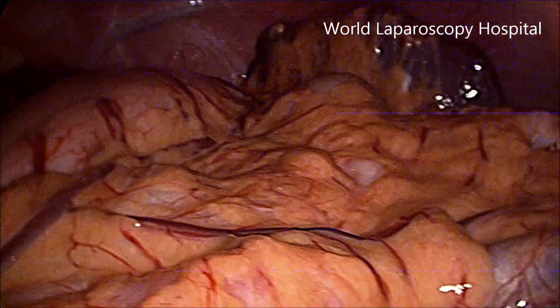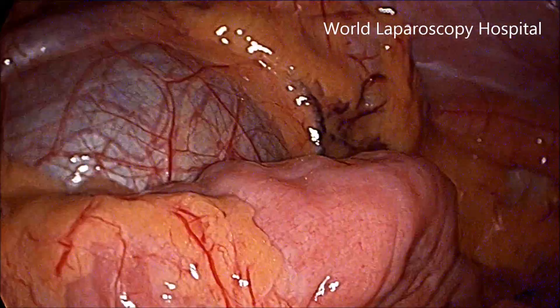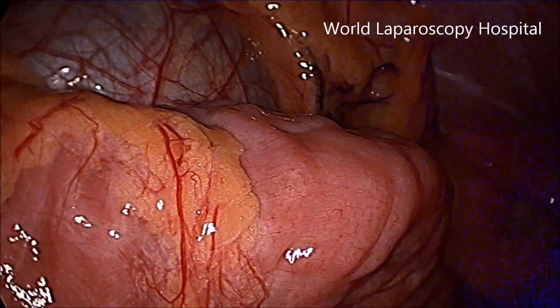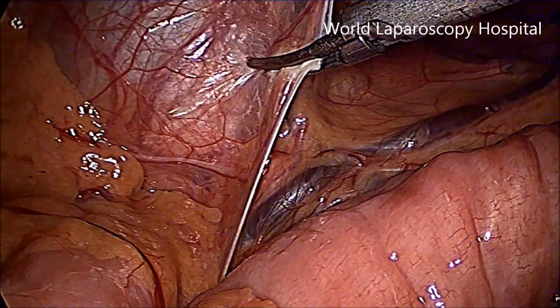Hello, this is a case of laparoscopic pyeloplasty. This is a 26-year-old male patient with PUJ obstruction. You can see the pelvis dilatation is just visible directly as soon as the telescope was introduced.